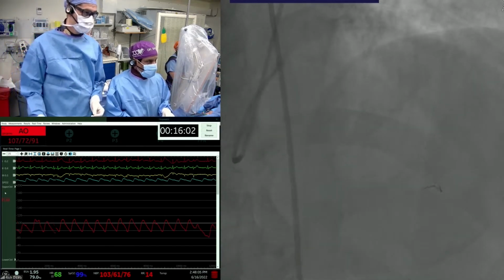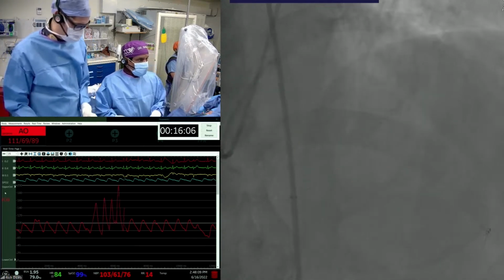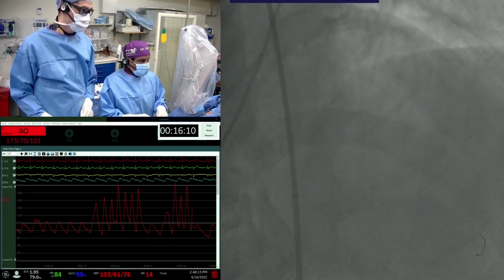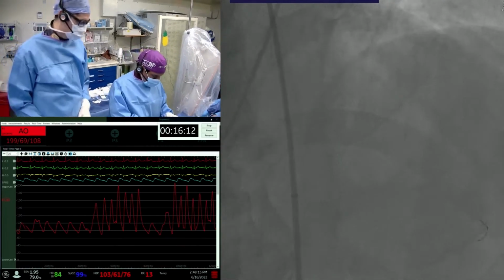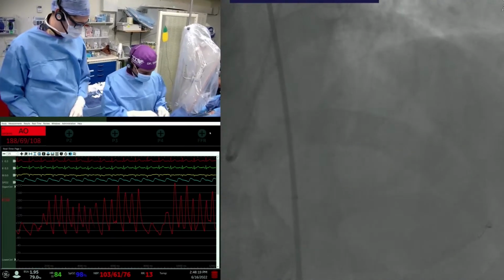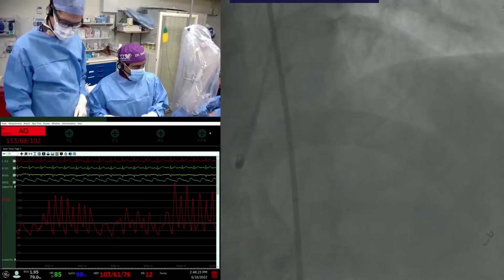I think it's a very novel concept to go with this device combination, as long as the order is ROTA first and ROTA cut second, because the cutting balloon is not indicated for calcified lesions, but it can give you maybe better expansion. That's, I think, the premise of the study.